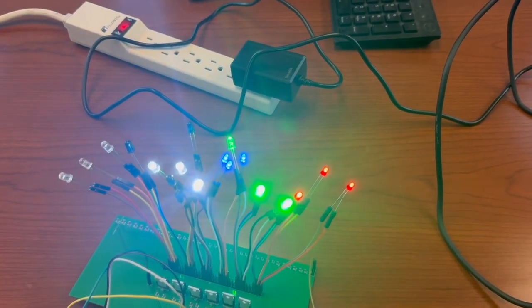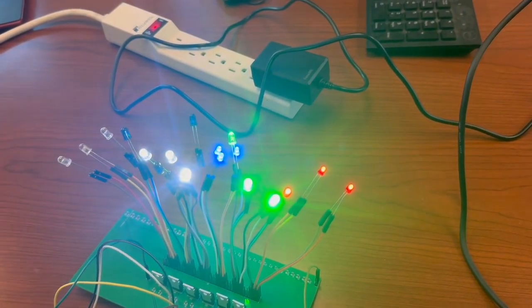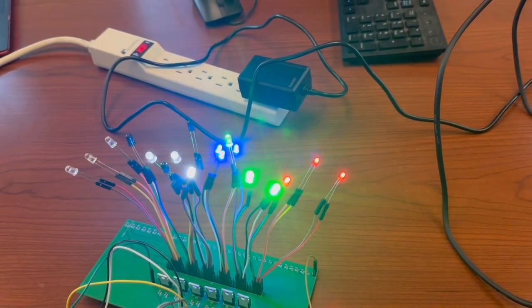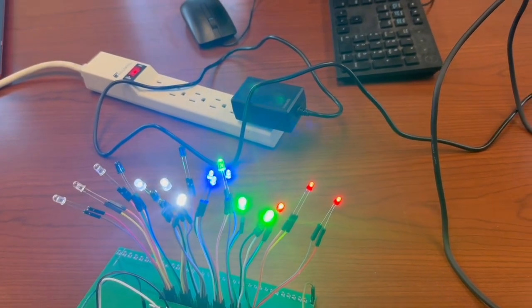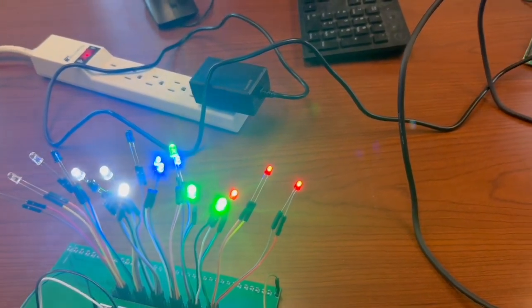The Arduino software starts with the white LED on to capture a color balanced image. Afterwards, based on the hex value of the center pixel of the image, we will step through the red, green, blue, 850 nanometer, and 940 nanometer LEDs. All the colored LED channels are turned on, but each LED dims and rises based on data from the image captured. Now I will walk you through the image processing techniques involved. But first, let's capture an image.